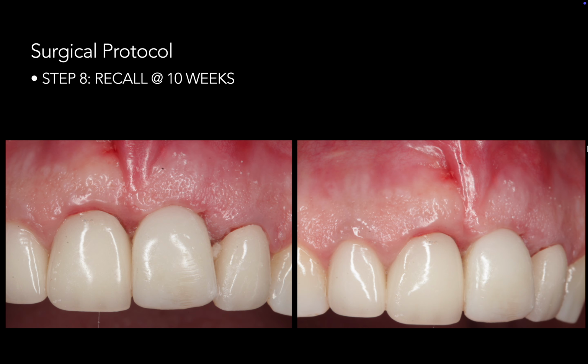And from the side profile, you can also see how I have maintained that labial emergence of the soft tissue as well as the hard tissue. So I was quite pleased with how everything was looking at this point of time. The patient's oral hygiene had also significantly improved as compared to immediate post-op.